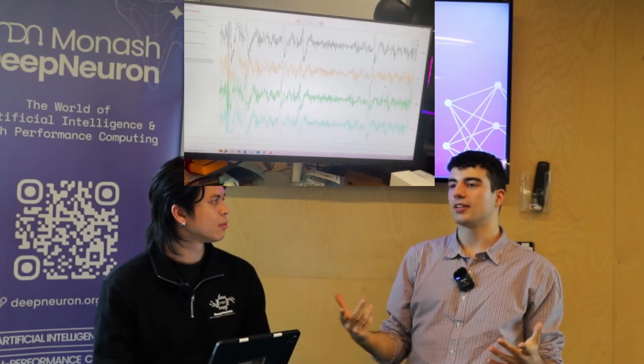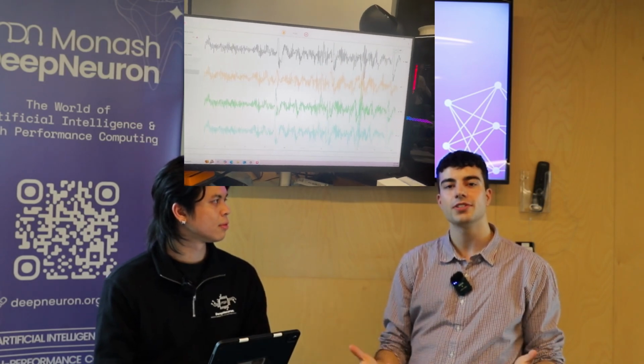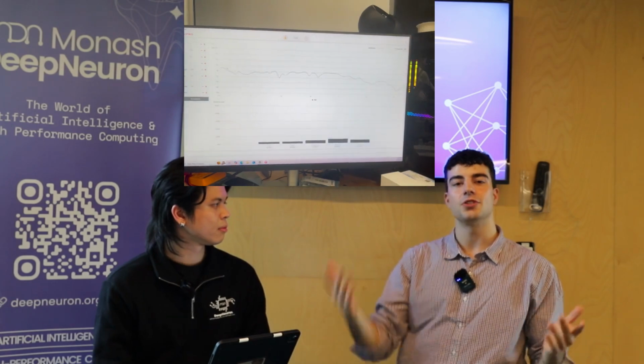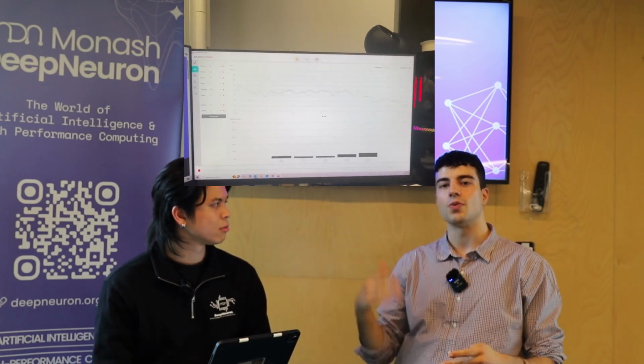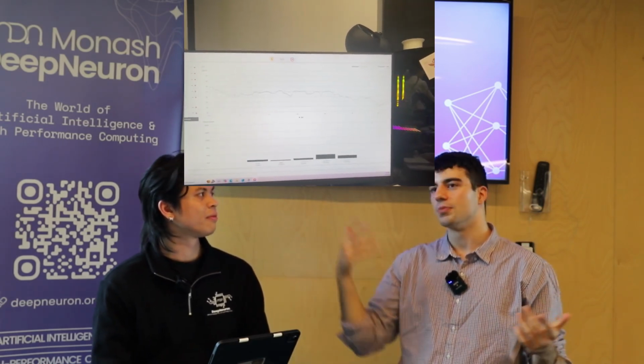And obviously the signals are still nonsense. So what you have to do is called a frequency domain shift. We're looking at things not in the time domain, but the frequency domain. And this gives you the brain waves you've probably heard of. Have you heard of alpha, beta, gamma, and theta waves? Once you get these different things you can quantify, we just chuck this into an AI classifier model, and it gives us the movements we want.